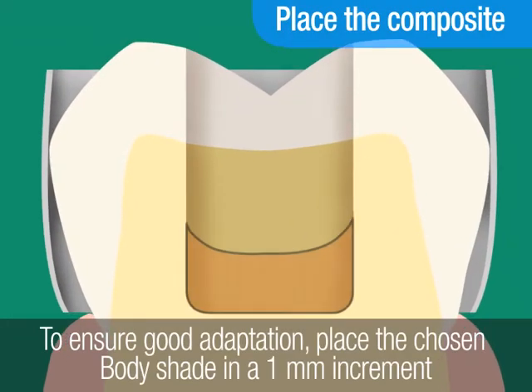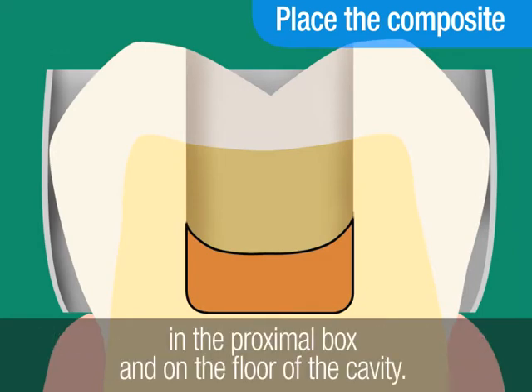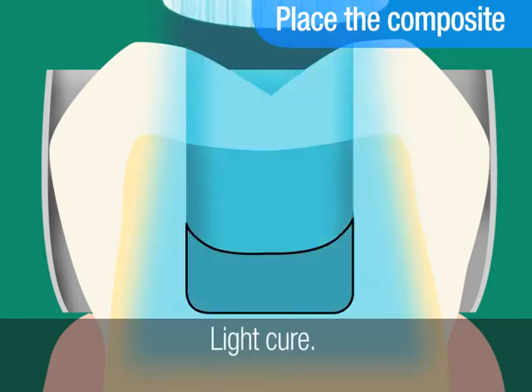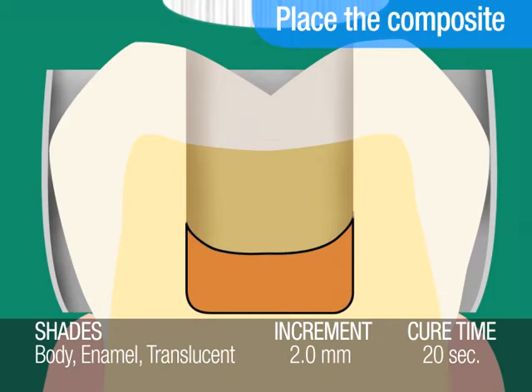Next, to ensure good adaptation, place the chosen body shade in a 1mm increment in the proximal box and on the floor of the cavity. Light cure. The cure time recommended for a 2mm increment of body shade is 20 seconds. However, for darker shades of A6B and B5B, the cure time is 40 seconds per 1.5mm increment.